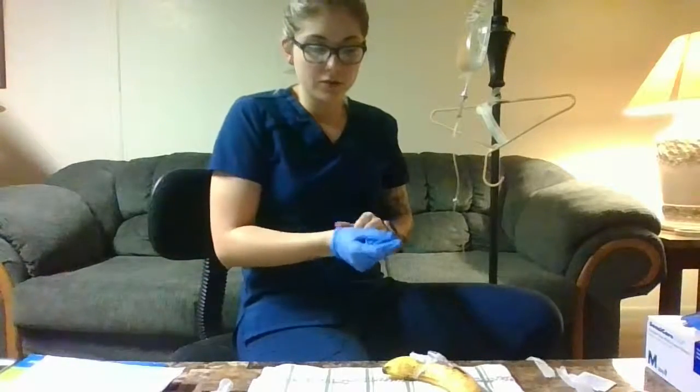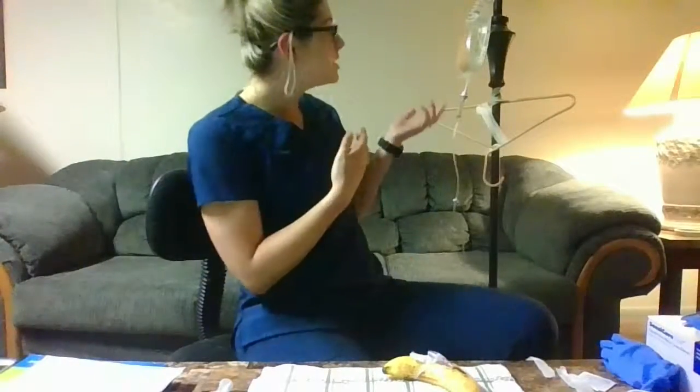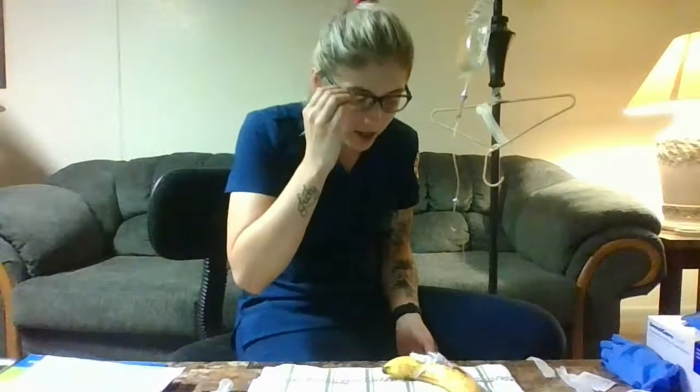You're going to explain to them, so it's saline locked, it's going to stay like that. You're not going to have anything running through it for now. We're going to keep it in just in case you need fluids or antibiotics or something later. So explain to them, not to get it wet. Be careful of hitting it on things. Make sure that the dressing is still on there, okay, so it doesn't fall out.